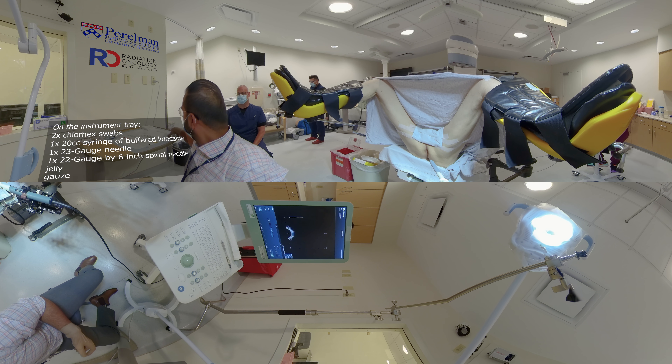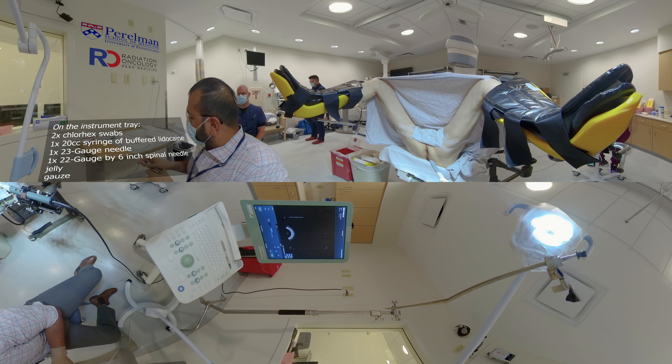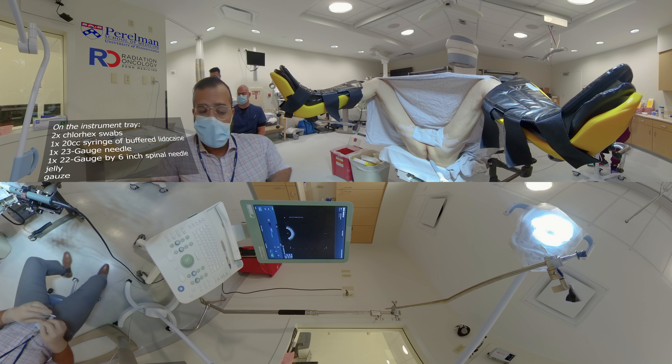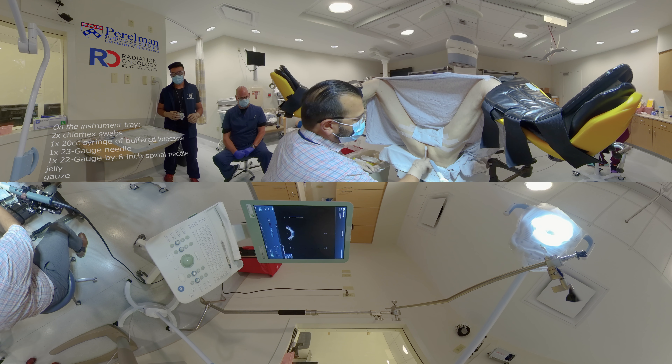Behind me on my tray are two chlorhexidine swabs to clean the skin, a 20cc syringe of buffered lidocaine, a 23-gauge needle with guard, a 22-gauge by 6-inch spinal needle, jelly, and gauze.